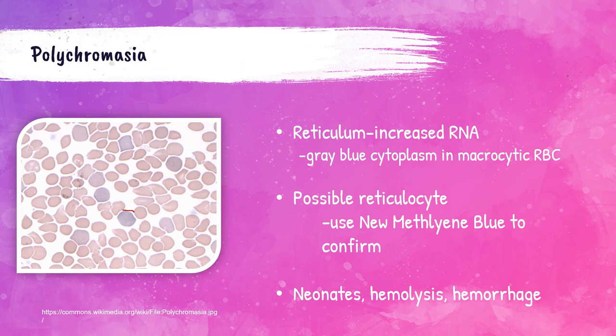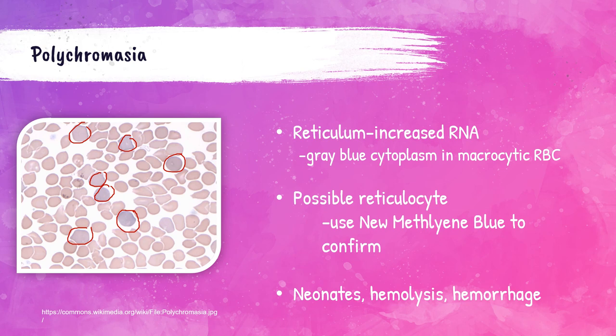When you see these in a smear with a Wright-Giemsa stain, they appear with a bluish tint and are referred to as polychromasia. This is a Wright-Giemsa stained peripheral blood smear — these polychromatic cells are also slightly larger than normal red blood cells, which makes sense because baby red blood cells are larger and get smaller and smaller until they're mature. To confirm that these are in fact immature red blood cells, a peripheral blood smear can be stained with a new methylene blue stain, where these polychromatic cells are referred to as reticulocytes or retics, and a percentage of reticulocytes can be counted using this stain.